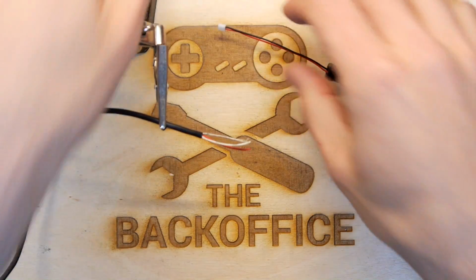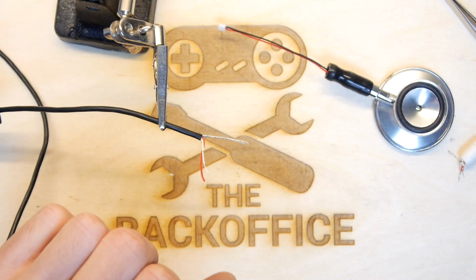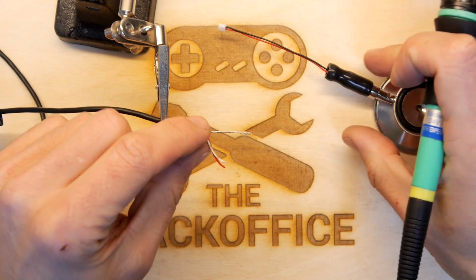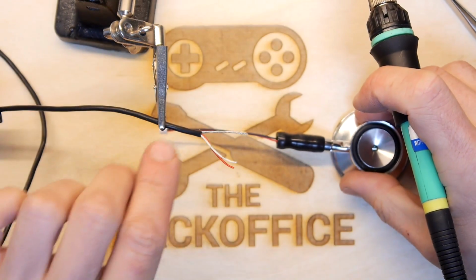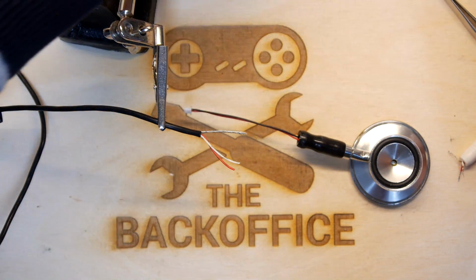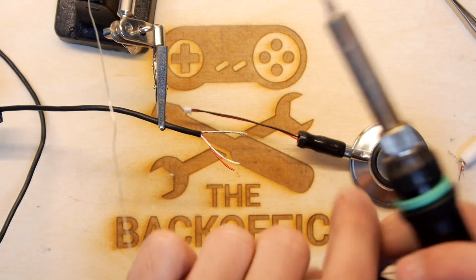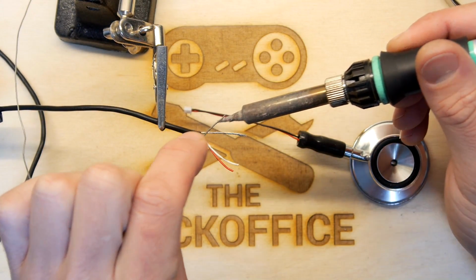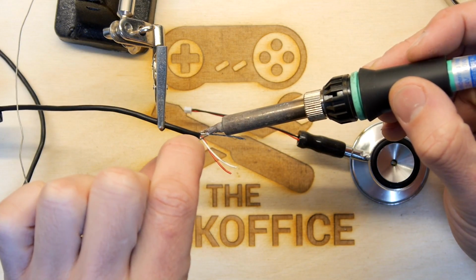So I think I'm just going to use one channel for now, because I don't really know the optimal way of mixing the two. I'm a bit reluctant to just hook the left and the right to one of these. It probably would be fine and you'll just get the left and right coming through, but I'm not going to do that yet. But please feel free to comment down below if that's okay to do. I mean, I could just go and look on Google, but if you're playing at home, there's something for you to do.